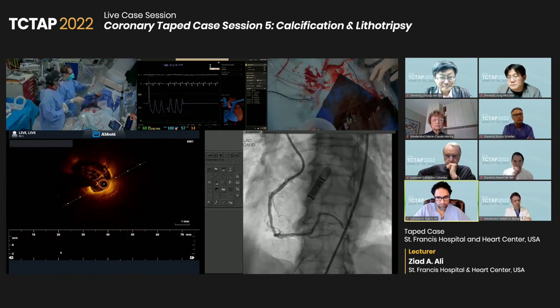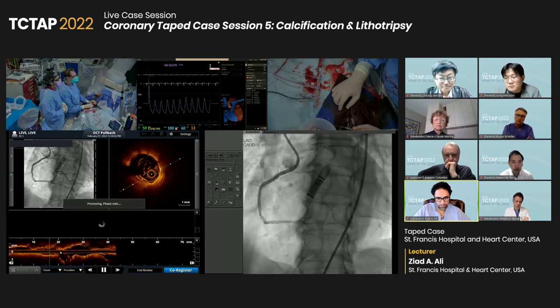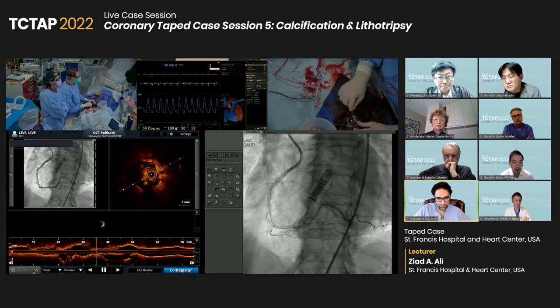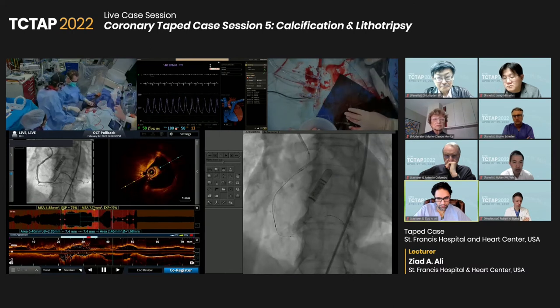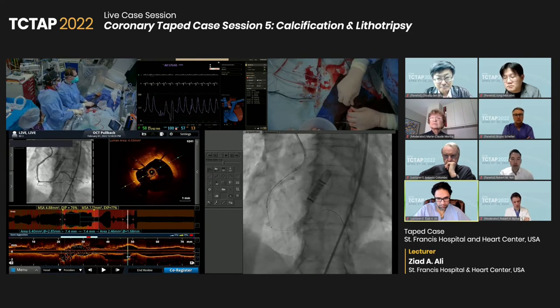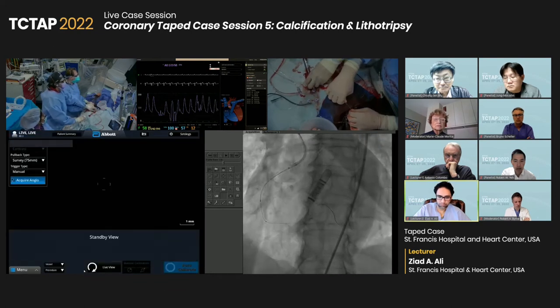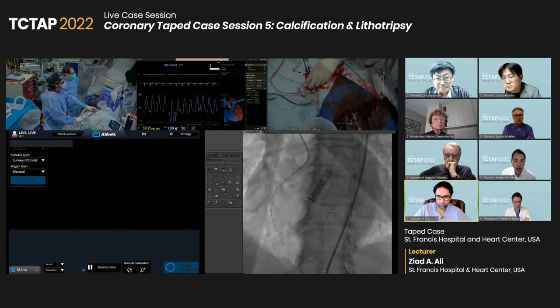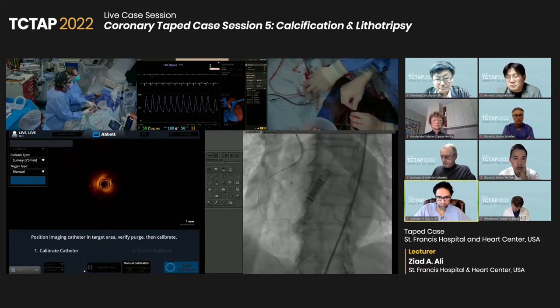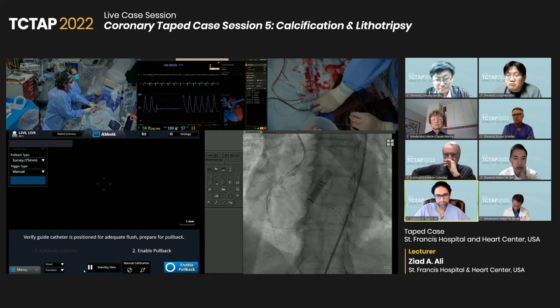I told you we should put the guide extender in. Well, we have to check the proximal edge. So let me come out actually a little bit and make sure we're okay there. A lot of chatter. Okay, well, why don't you put your guide extender in? Let's do one more run, and then we'll do the proximal edge. Okay. Yeah, I'll inject. Yeah, you hold the catheter, Alan, please. Let's flush the catheter. Okay. All right, I'm ready. Just if you can avoid dissecting the vessel, it'd be great. Don't worry. I can do this. Okay. Ready? Yeah. Go.